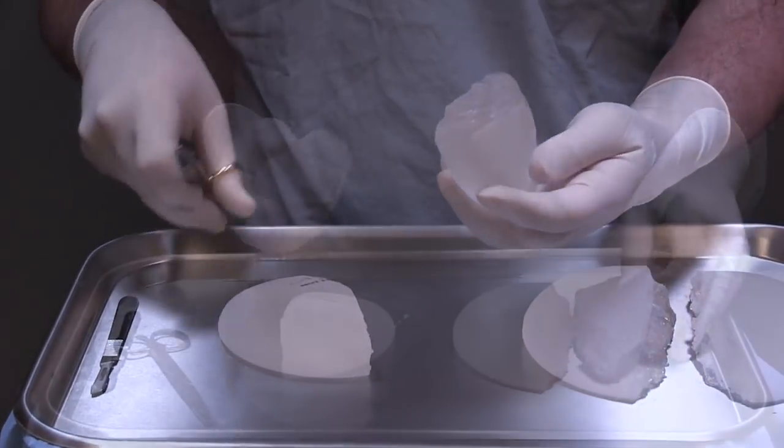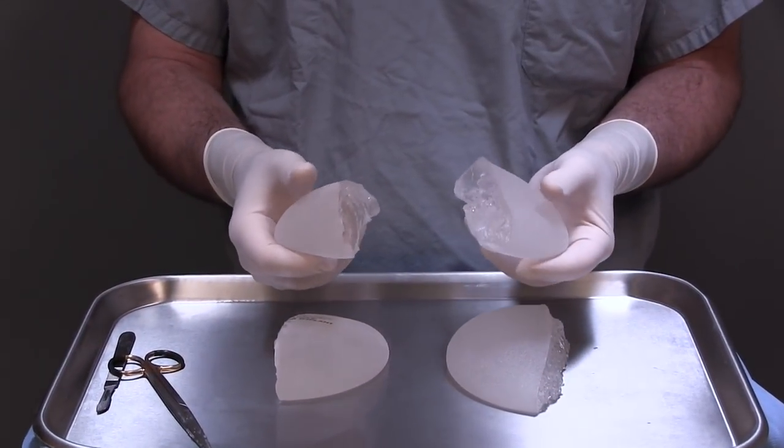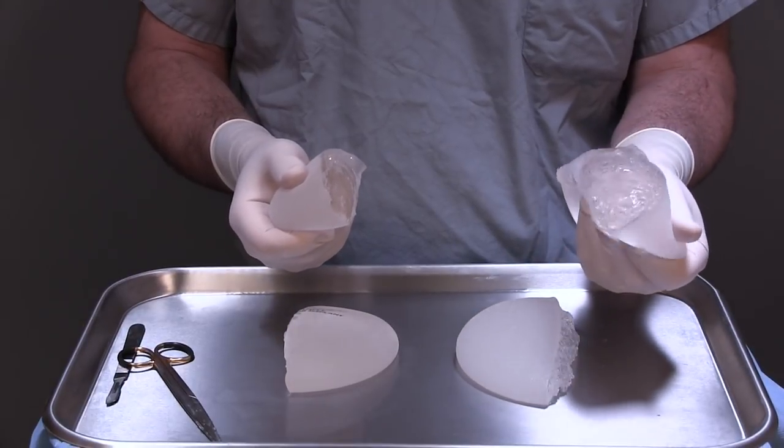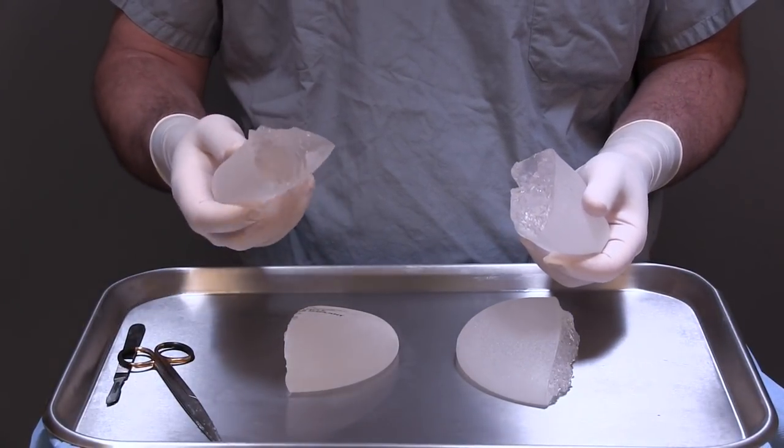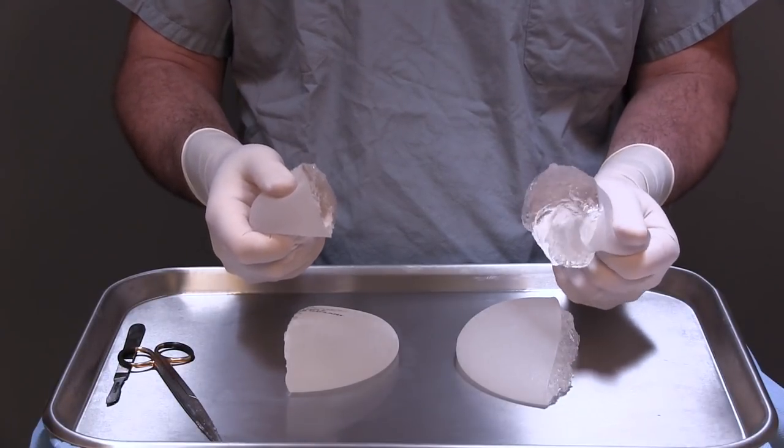As I squeeze it, it also bounces back to shape a little more adeptly than the other ones. It seems to me it probably is a little bit safer, although I have to admit it's also a little bit firmer than the first one.